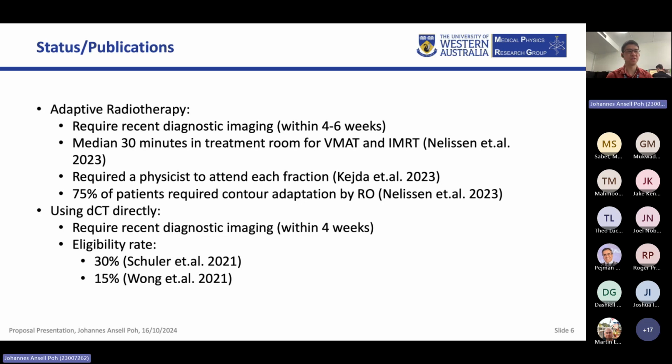For this research, I believe they only consider palliative patients, but they still have this low eligibility rate because of some different techniques used in the diagnostic imaging that's different from treatment planning, like planning CT techniques with the curved couch, and also some mention about like respiratory gating for lung patients, which can also be different. Okay, thank you very much.